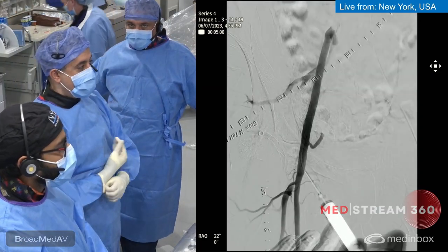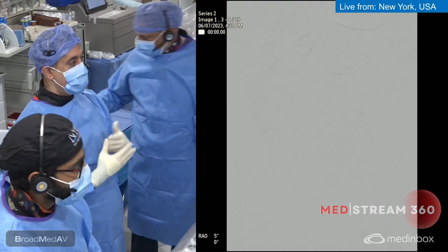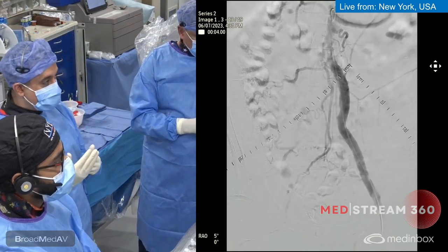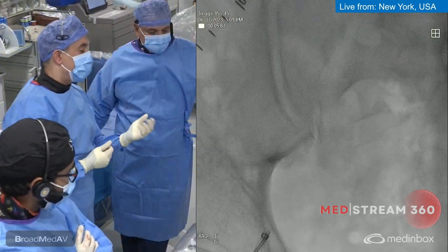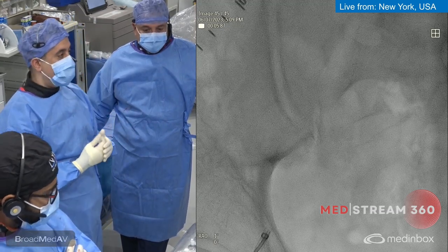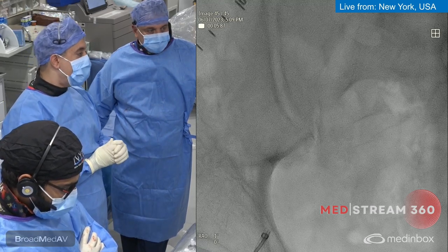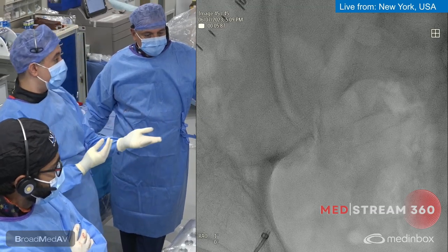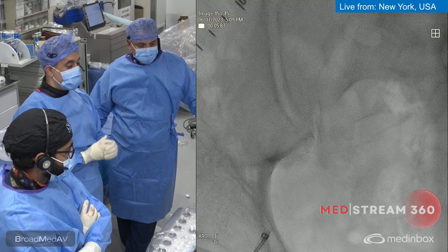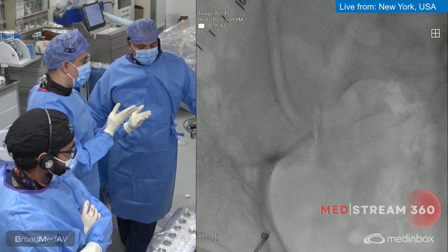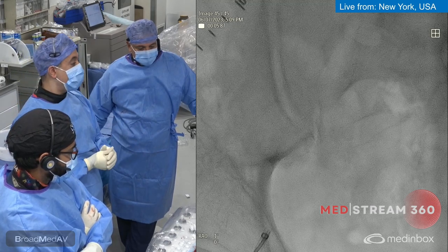This is a great case to review, especially for patients presenting with iliac CTOs. Doing an iliac lesion is one thing, but iliac CTOs require a different thought process — you have to ascertain the CTO location, the proximal cap, the distal cap, whether it's common iliac or external iliac, if it extends into the femoral arteries, and what the pathology is. In this case, the patient has a right common iliac CTO. Endovascular treatment is the preferred approach given his risk factors, though fem-fem bypass and other surgical options exist. With evolution of stents, devices, wires, and catheters, our endovascular success rate has been exceptionally high.